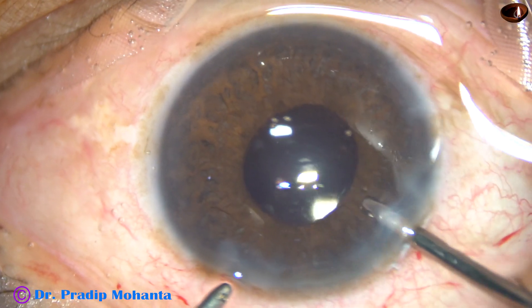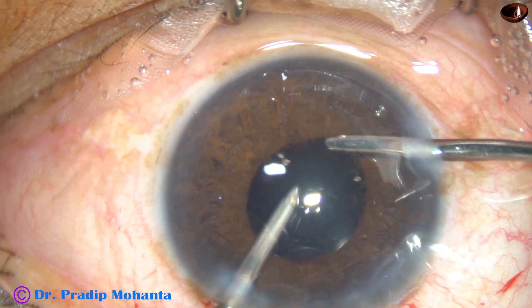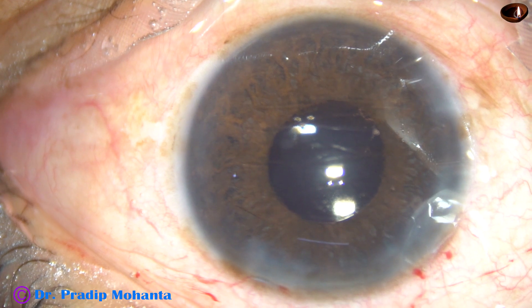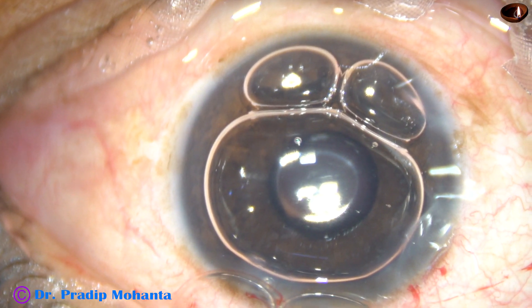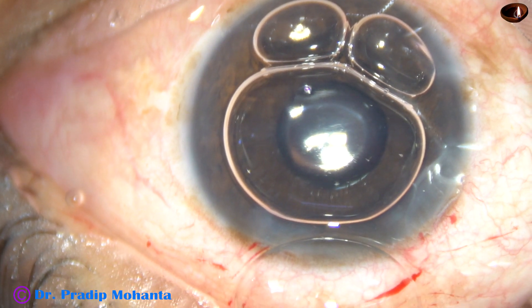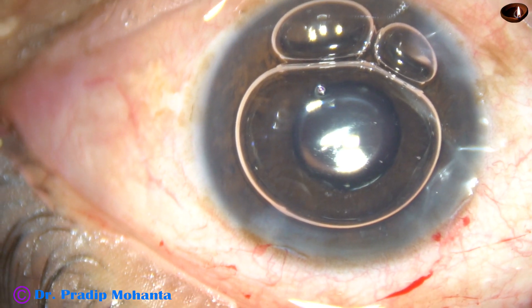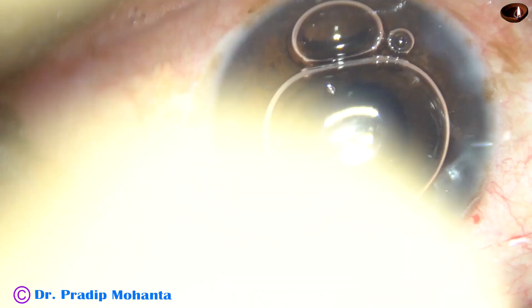You can see that the pupil is round and there is no sphincter pupil damage. If we use iris hooks, we tend to pull vigorously and cause some damage to the sphincter pupil. But this device dilates the pupil moderately and will not cause any damage to the sphincter. That's why the pupil is round and there is no distortion. Now the paracentesis openings are being closed by corneal stromal hydration.